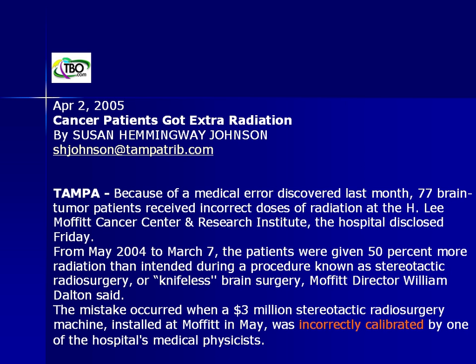You can see there were 50% more radiation was given than intended during a procedure known as stereotactic radiosurgery. So the background to this was a new machine that was installed, and maybe you can't read that, but it says incorrectly calibrated by one of the hospital's medical physicists. So I don't like to see that.